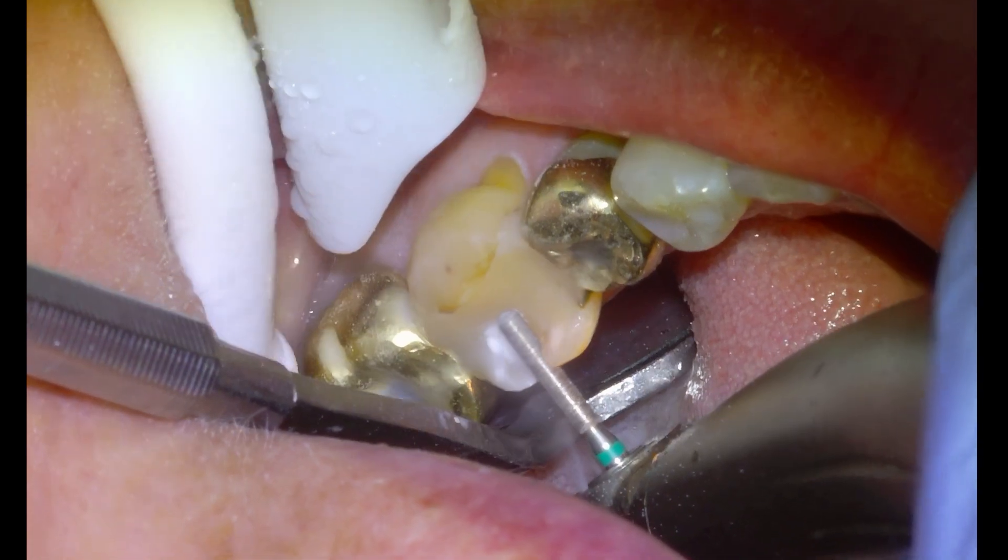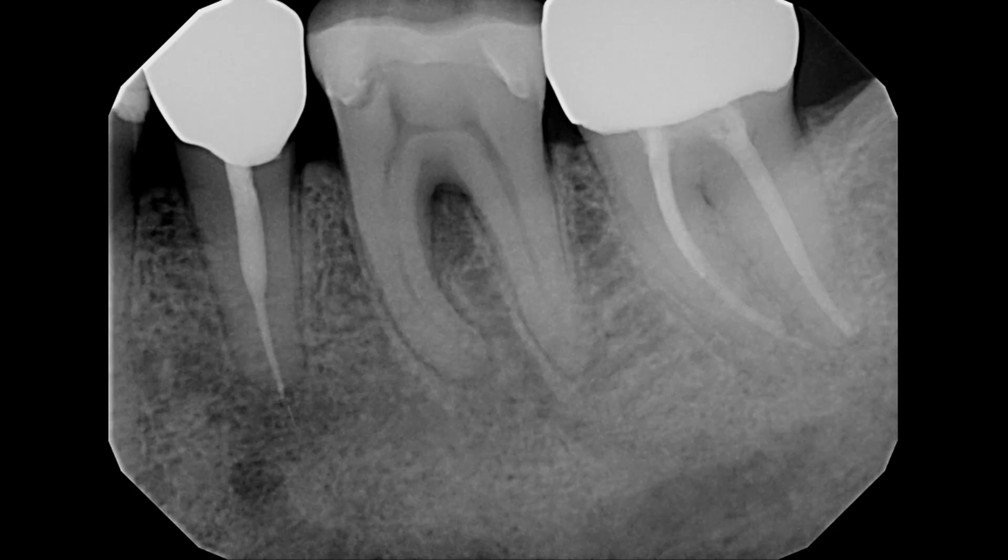What does a successful root canal and crown treatment look like? This is an x-ray taken on a patient who complained of pain in their lower left jaw when they bit down. We can see on the x-ray that there is a failing root canal on the second premolar, indicated by a dark lesion surrounding the root tip, which represents a chronic dental infection.